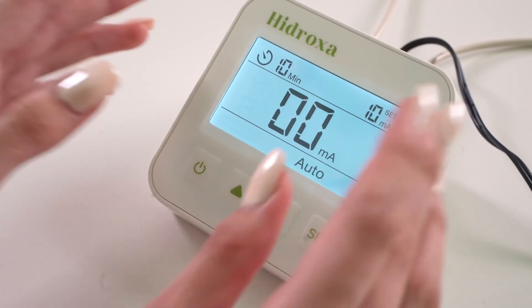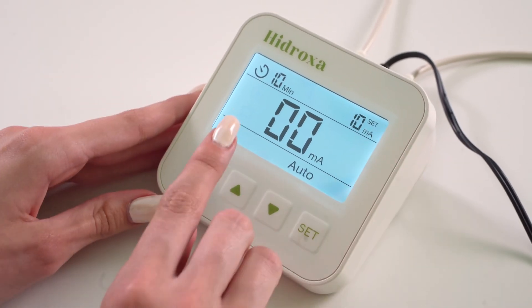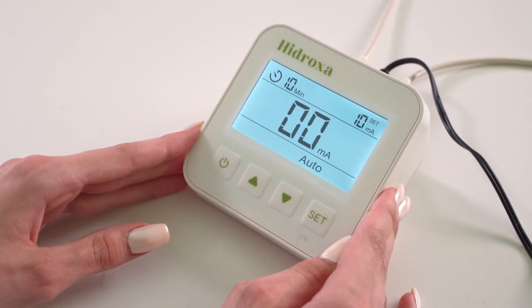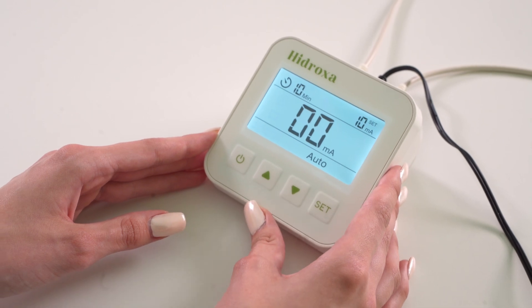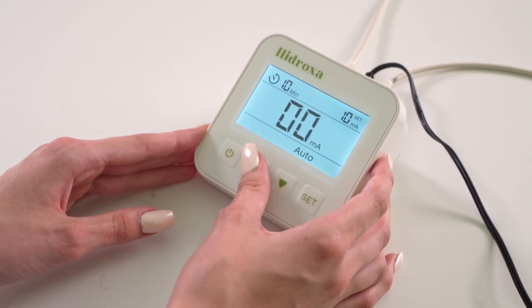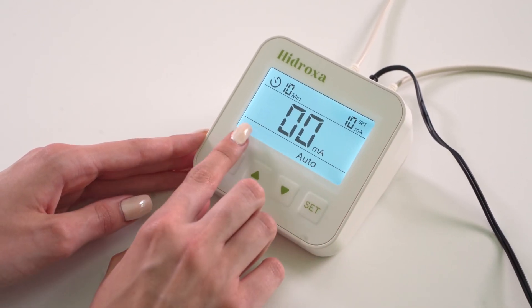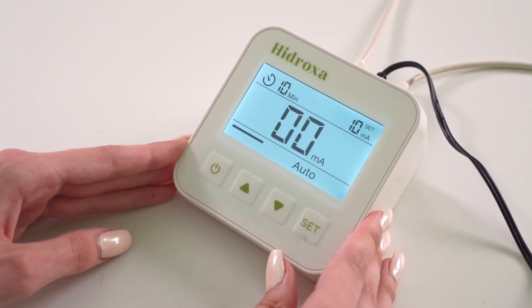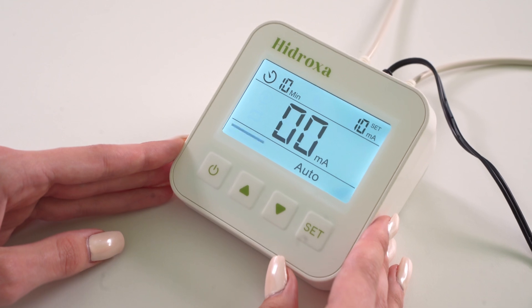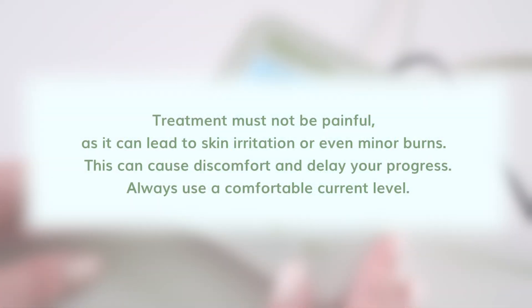Let's look at the key features. Pulsed mode delivers gentle bursts of current, making it more comfortable on the skin. We recommend starting with this setting for all users. Constant current provides a stronger, steady output and can be used when pulsed current has not been sufficient, especially for the feet. Treatment must not be painful, as it can lead to skin irritation or even minor burns, which can cause discomfort and delay your progress. Always use a comfortable current level.